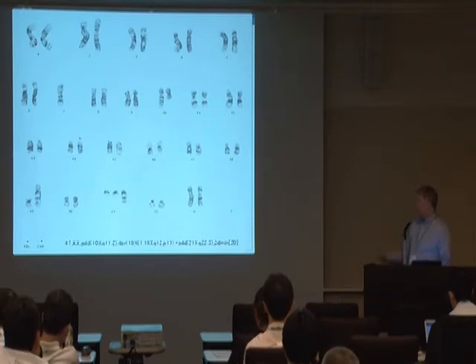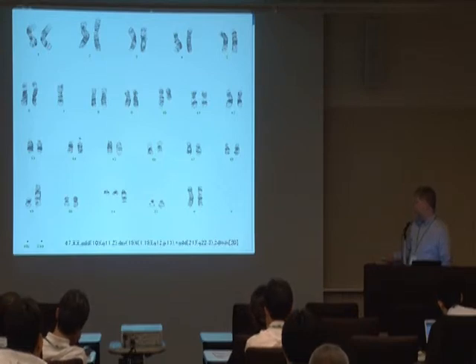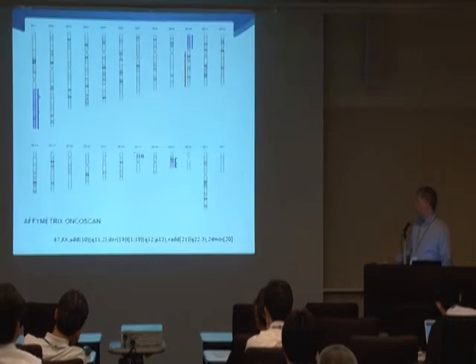So one final case just very quickly to look at here. And this is an interesting case where we had a very unusual chromosome 10 here, missing most of the Q arm, and a derivative 19, so this chromosome 19 here with most of an extra Q arm from chromosome 1 added to the top of it, plus a very strange chromosome 21 with a bunch of additional material.